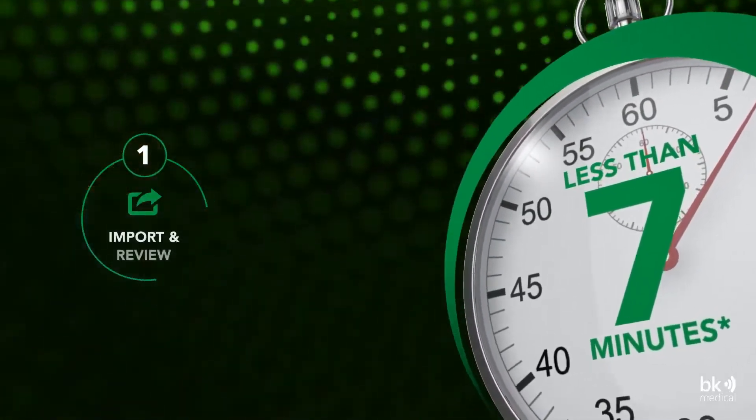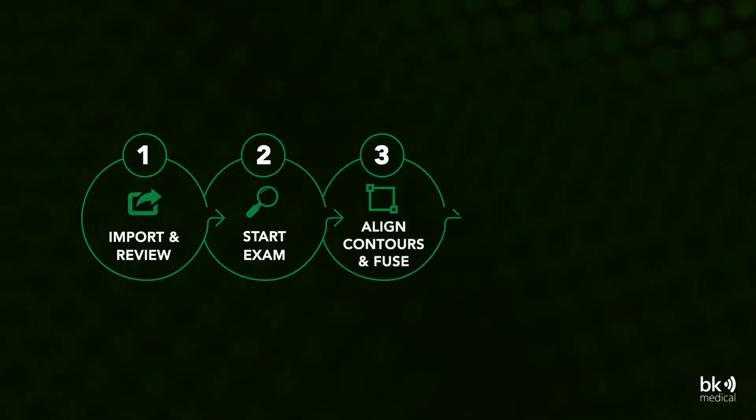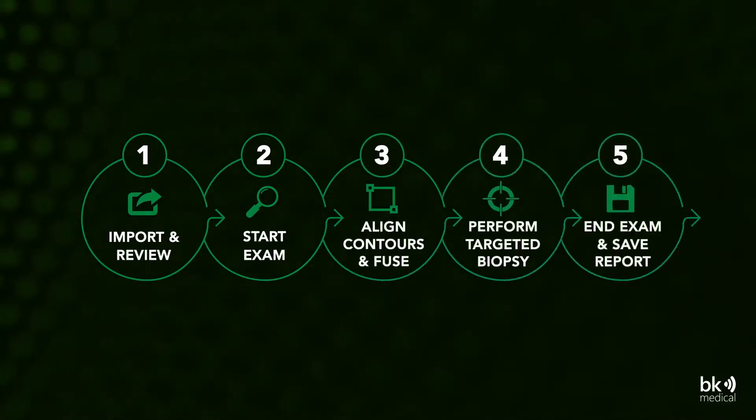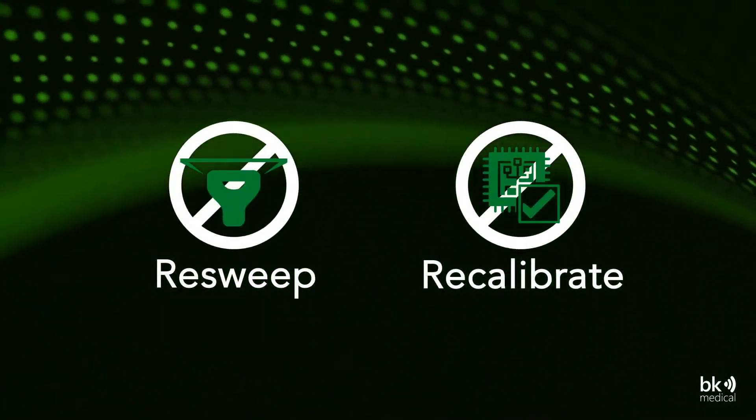BK Fusion has just five simple steps and offers an easy and familiar workflow for the urologist to maintain control throughout the procedure. Make adjustments along the way without the need to resweep or recalibrate the ultrasound.